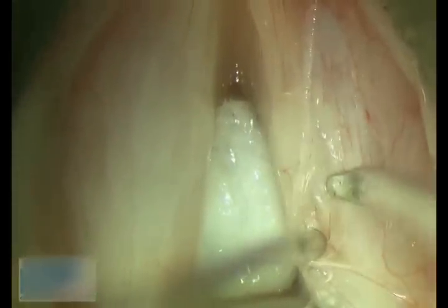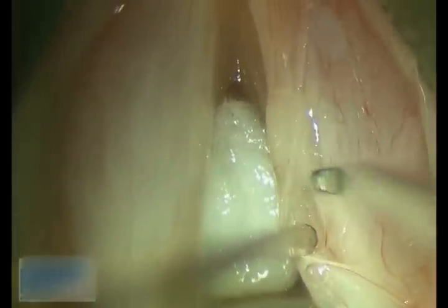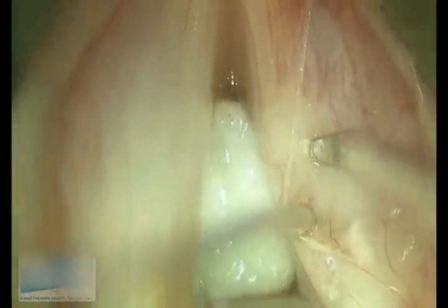Once the cyst is clearly delineated, it is then dissected free from the underlying vocal ligament. As you can see, the cyst can be quite adherent to the vocal ligament, and care must be taken not to rupture the cyst.